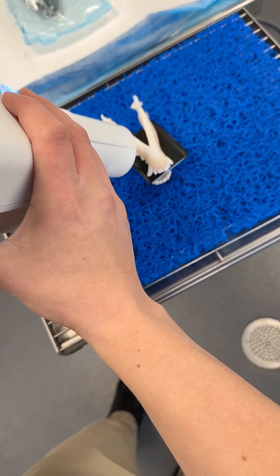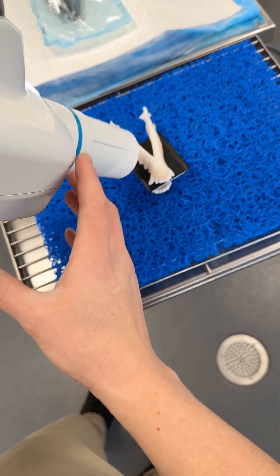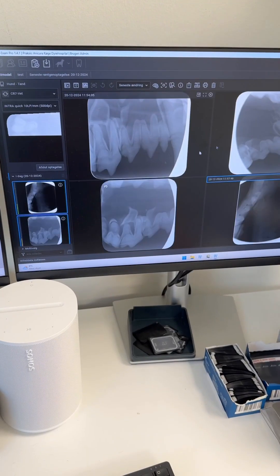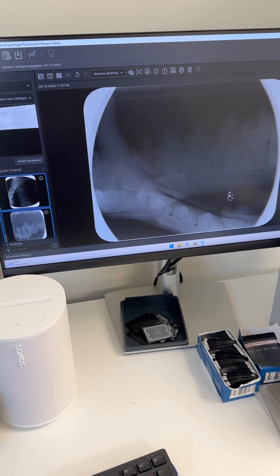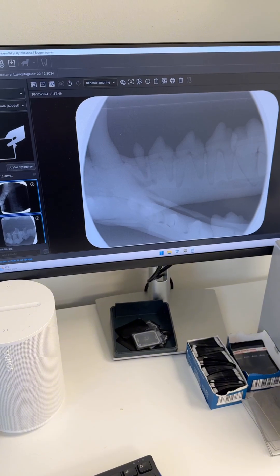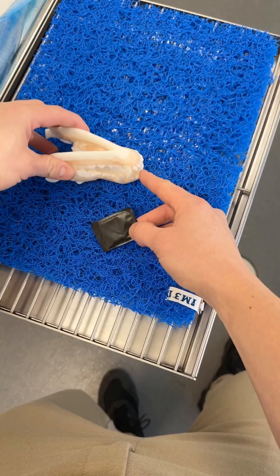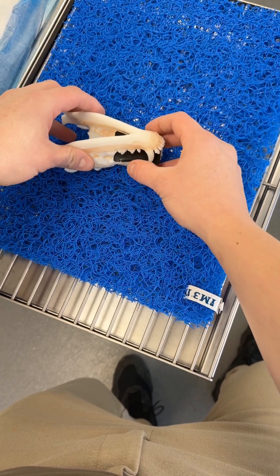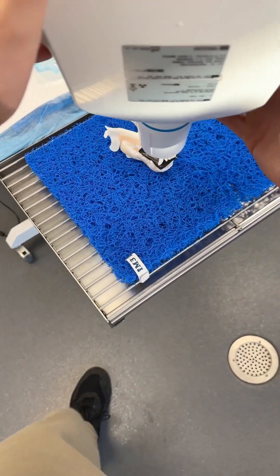Here we are trying to take an x-ray of the lower premolars. And as you can see, you get some pretty nice images. You have to fiddle around a little bit with the contrast and lighting exposure, but it works pretty well. Here's the lower canine, which is traditionally a tricky tooth, using a size 2 film.